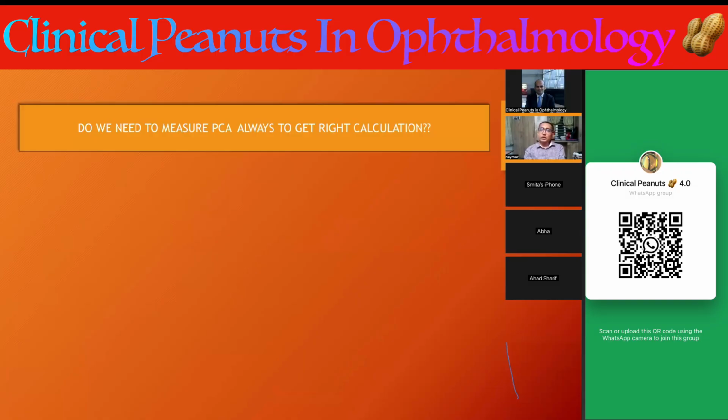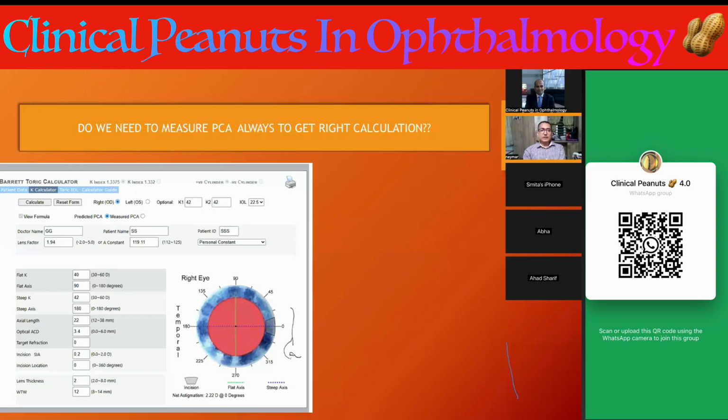So the question is, do we always need to measure posterior corneal astigmatism to get the right calculation? The answer is no. The uniqueness of the Barrett toric calculator is that it uses predicted posterior corneal astigmatism. As I said, most posterior corneal astigmatism lies in the vertical plane, and its value is in the range of 0.2, 0.3, 0.4, like that. They have a nomogram, and with the help of normative data from the nomogram, they use the predicted PCA to calculate the power.